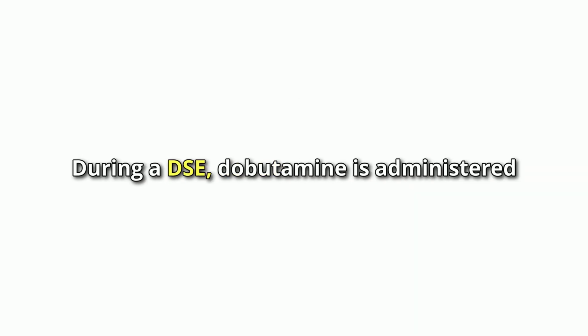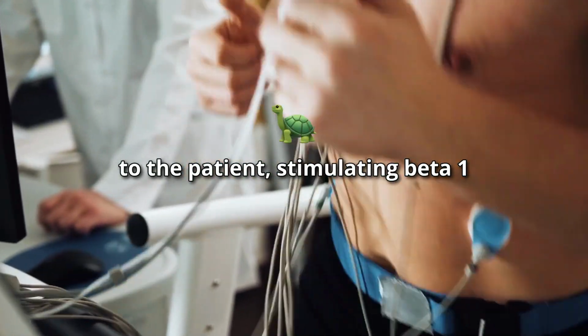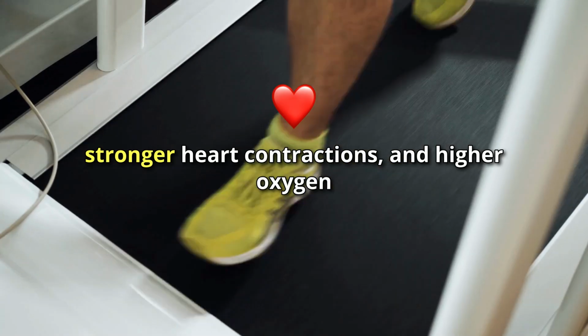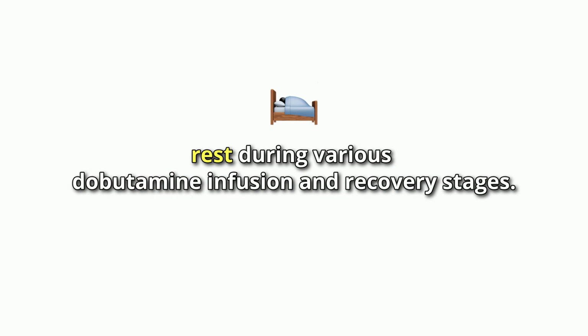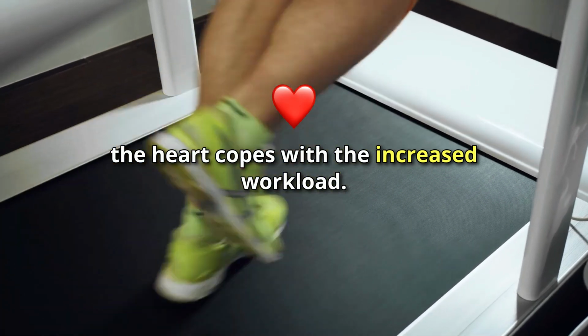During a DSE, dobutamine is administered to the patient, stimulating beta 1 adrenergic receptors in the heart. This leads to an increase in heart rate, stronger heart contractions, and higher oxygen demand, mimicking the effects of physical exercise. Echocardiographic images are captured at rest, during various stages of dobutamine infusion, and during recovery. These images allow cardiologists to see how the heart copes with the increased workload.